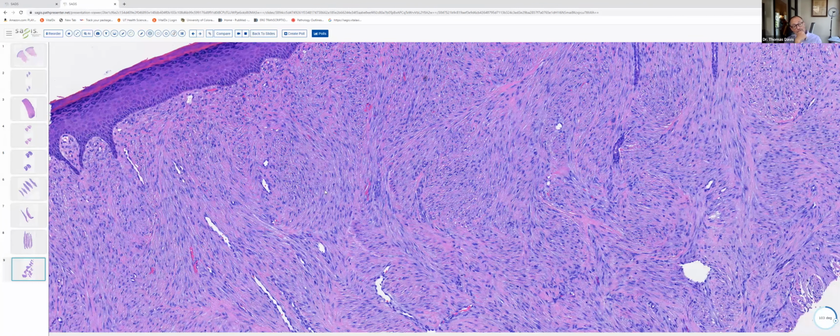Well, I hope the slides here were helpful for you. I hope it gave you a chance to practice your skills. For those of you who are just starting out, hopefully, if you can put it in the right box, tumor, neoplasm, deposit, whatever, that's great.